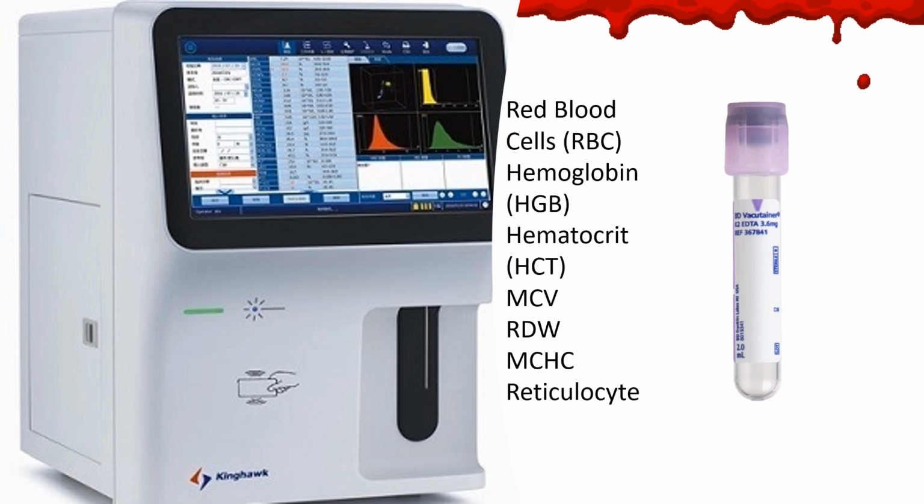So, independently of everything, this is just for you to have a reminder that we cannot just react on a first blood test result. Yes, we look at it, we plan, and we evaluate again, and we retest again. Remember that not only the blood test result may yield a wrong test value or result, okay? But as well, there are other problems or errors that will occur where? In the analytical phase and in the post-analytical phase.